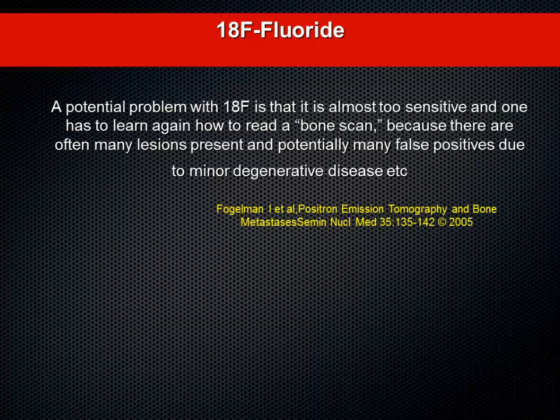You can't just switch off from the MDP bone scan today and start your fluoride scan tomorrow. It's not going to work. You have to have a learning curve. You need to understand the normal variants and the pitfalls. And we have not experienced this, though the fluoride tracer came somewhere in 1962, the technological advancement didn't match it for imaging, but now it's again regaining importance. But there will be a learning curve before we switch over.